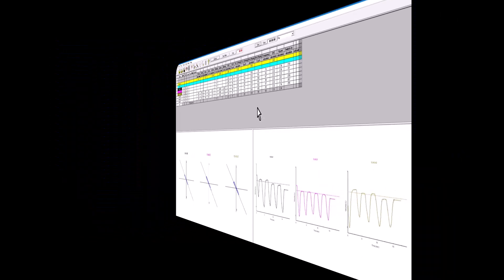Look at each tracing to see if the line of best fit is appropriate. Once all adjustments have been made, you can now check which efforts you want to average for the final report.